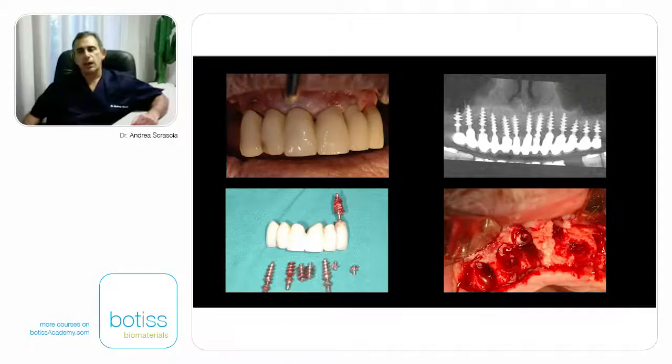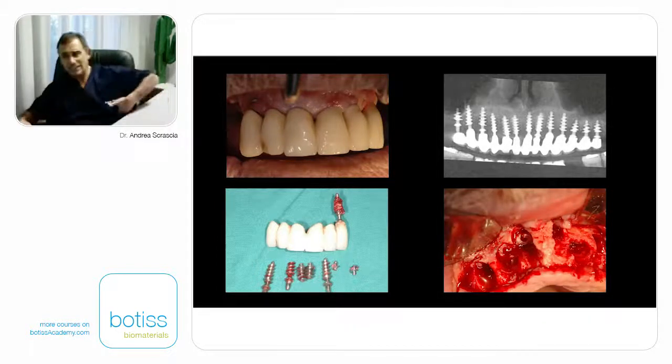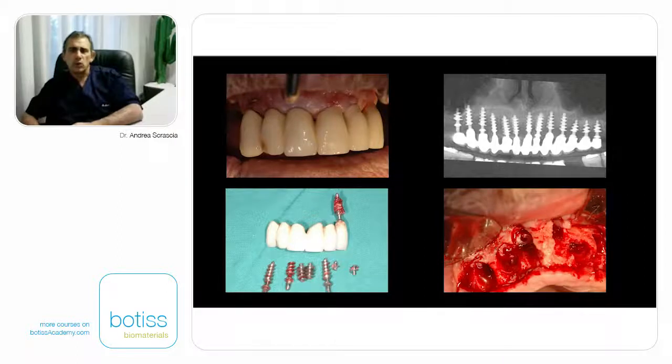Next clinical case worth reporting. A 73-year-old patient came to my attention after having had implant treatment 3 years before. This is a very recent case, so I cannot show the finished result of the healing of the tissue, but it is a very difficult case, where a lot of connective tissue was needed to recreate tissue traumatized by a wrong implant in a poor position.